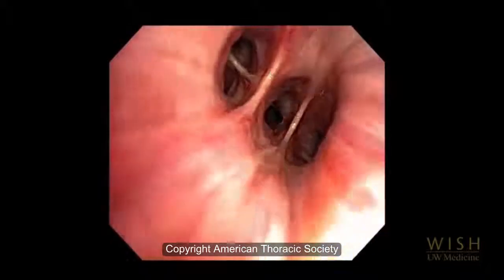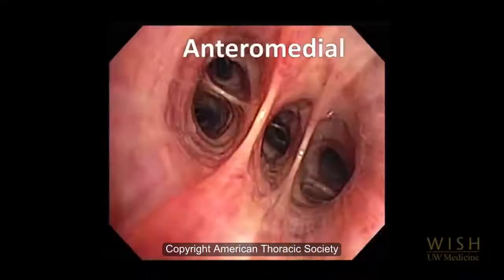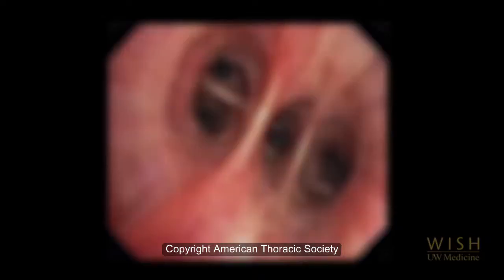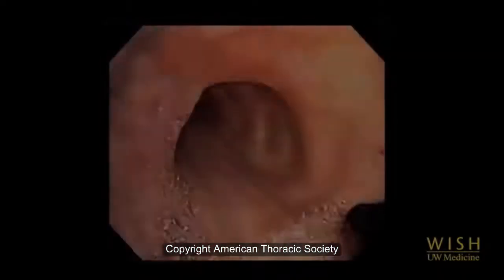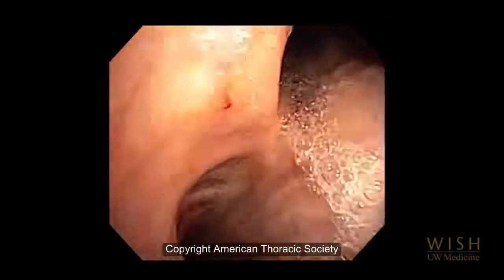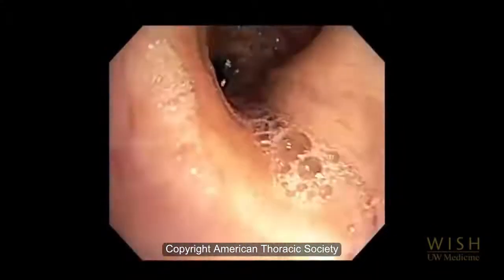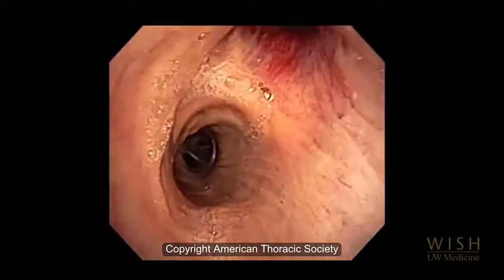The left lower lobe bronchus then divides into anteromedial, lateral, and posterior segments, forming the mnemonic ALP when the bronchoscope is held in anterior-posterior orientation in the left lower lobe bronchus. After completing full inspection of one lung, return to the main carina to begin inspection of the other. The bronchoscope is entering the right mainstem. The distance from the main carina to the right upper lobe bronchus is shorter than from the main carina to the left upper lobe bronchus.